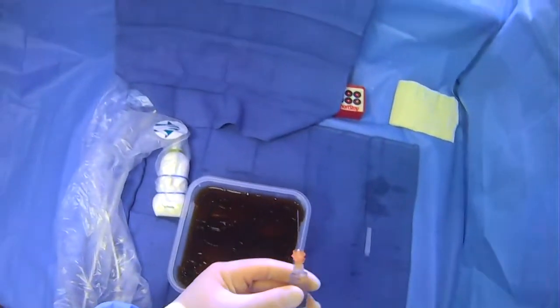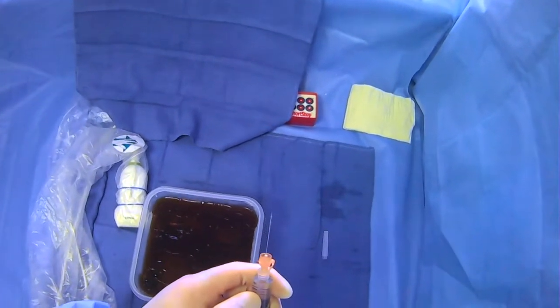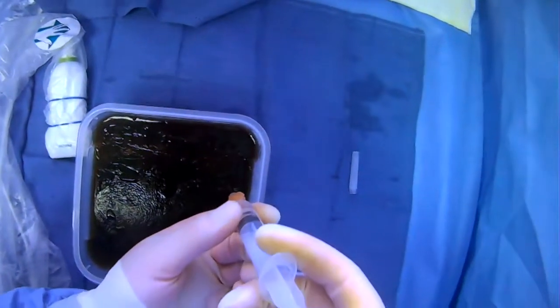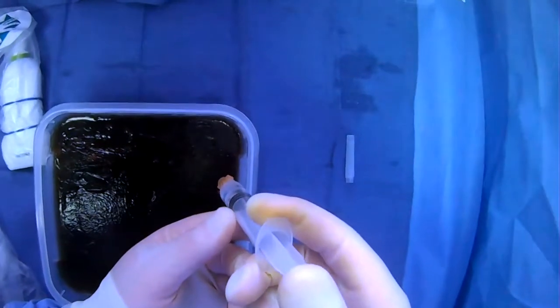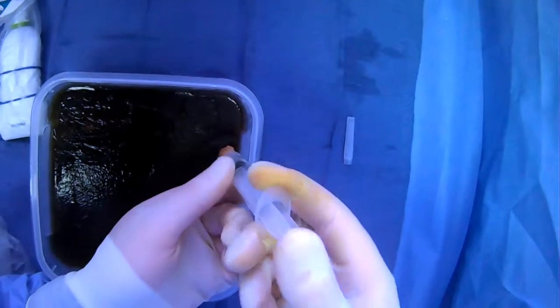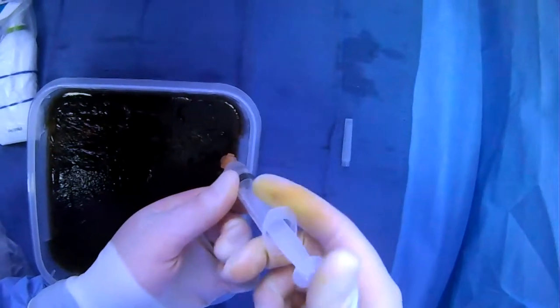What I'm going to do is make sure there's no air here, and we're going to go in at the marked site. We know the trajectory we're going to take, and basically as we go in, we're going to start giving lidocaine, giving lidocaine, go deeper, and then when we get kind of halfway, we're going to try to aspirate.